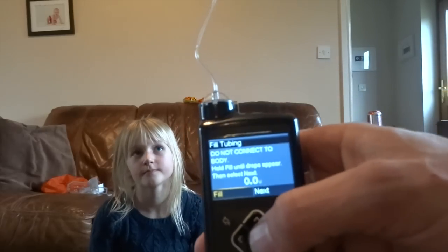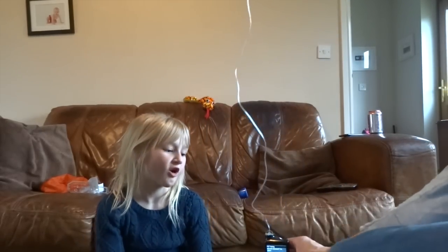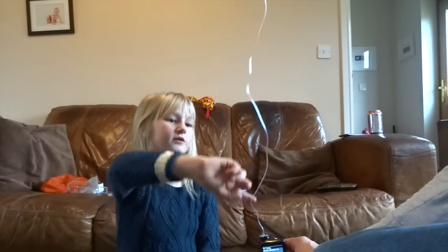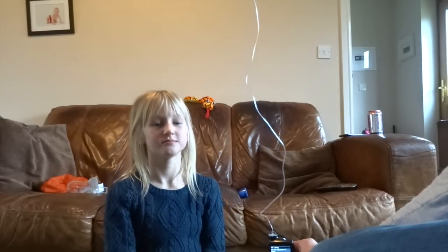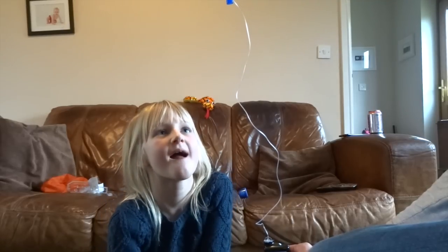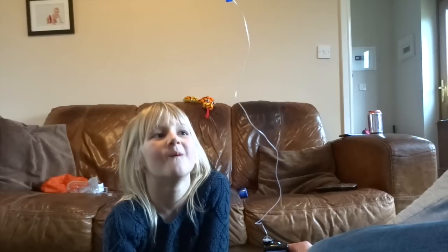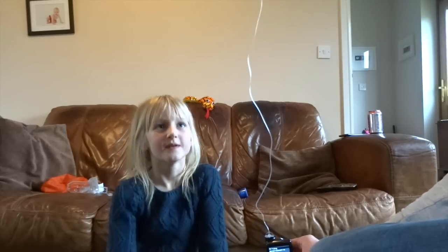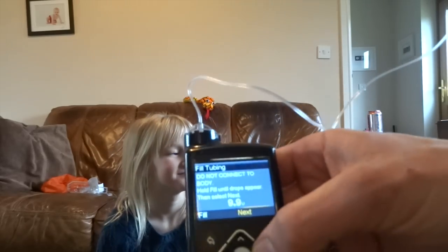And while it's filling — what happens to the insulin, Martha? Some of it drops. Where does the insulin go? Down this long tube. That's exactly it. So let's keep it pressed down. You tell me when you see the insulin coming out the top. So we've got a drop at the end of the tube, and it will say that as well — three drops.